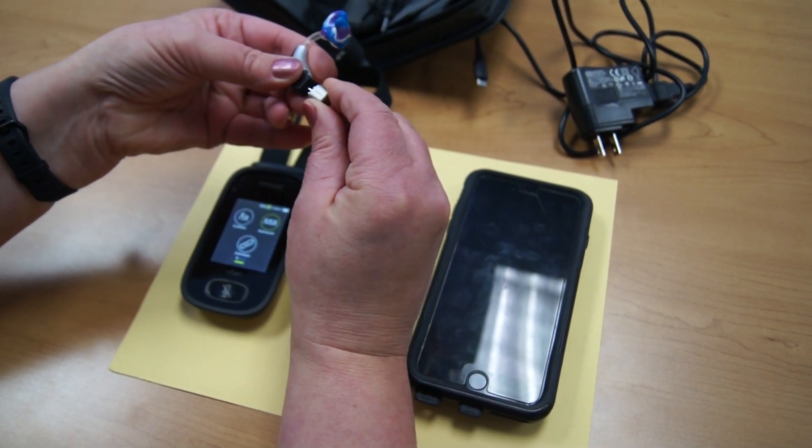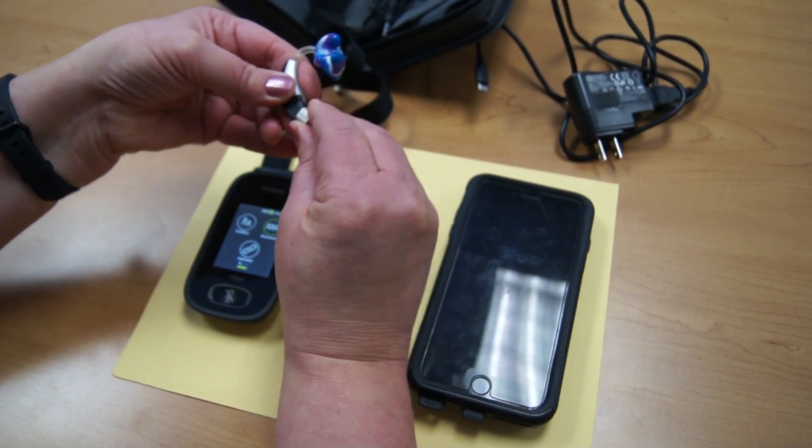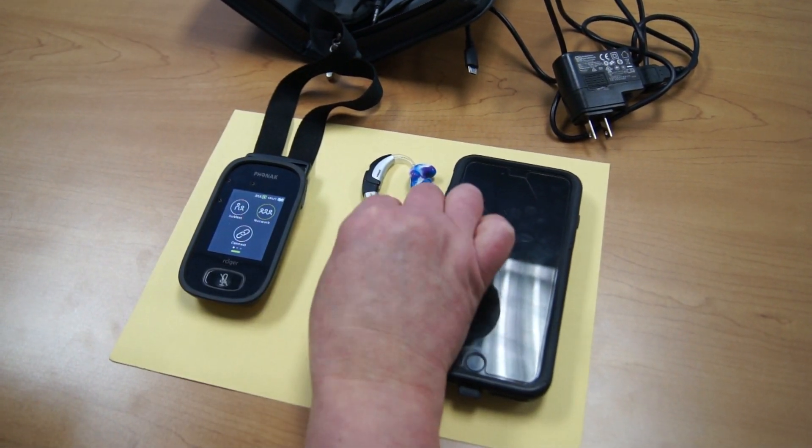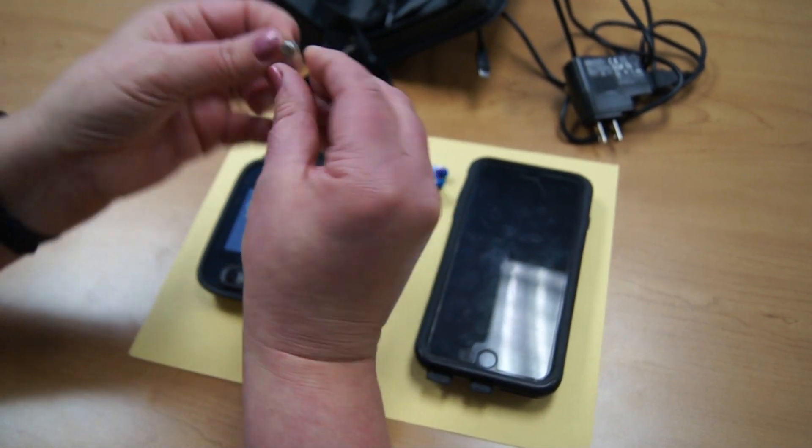This is a Roger X and connects to a hearing aid. You want to make sure that you have a fresh battery to start. Once you take a battery out of the pack, you're going to take the sticker off.